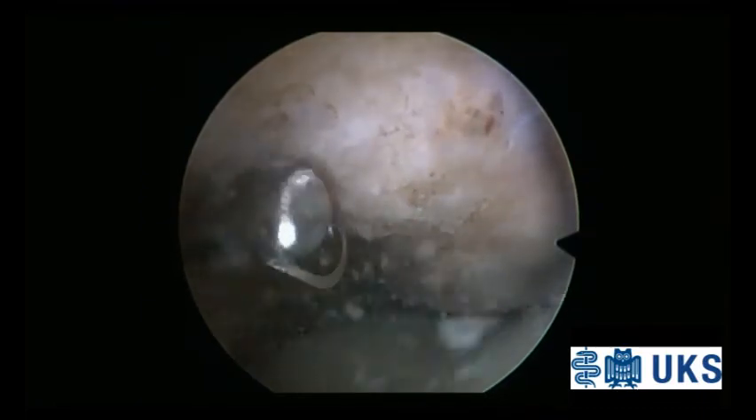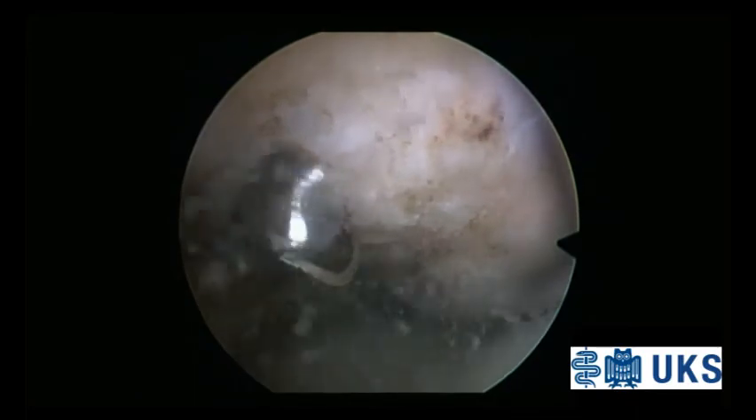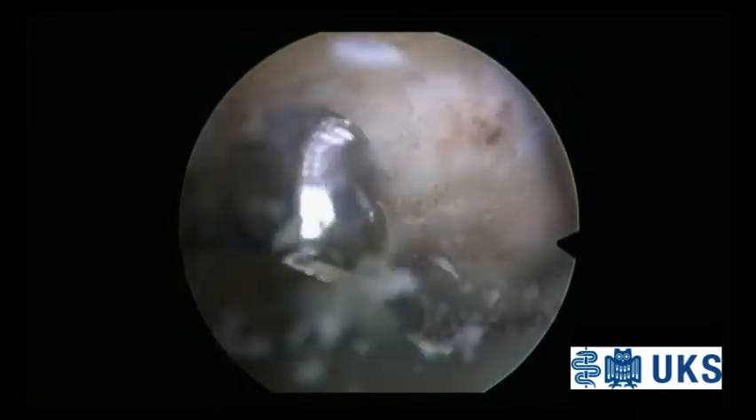The resection of the lower patellar pole is performed step by step using a 4 mm burr.